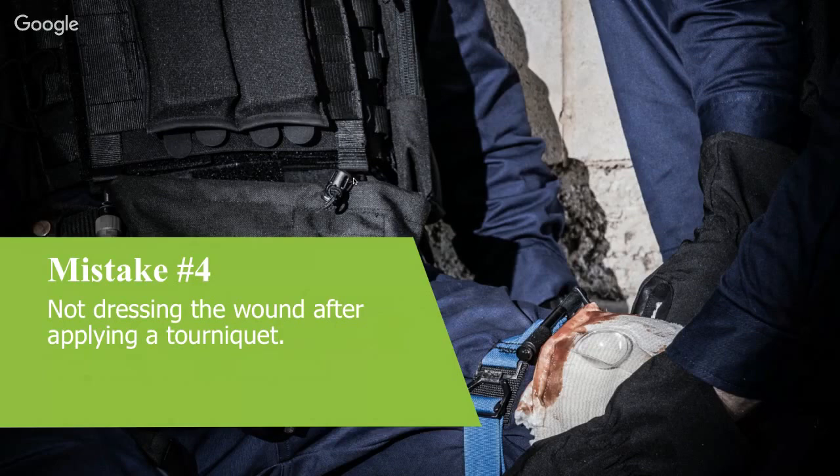The second thing is, apart from anything else, it will continue to ooze a venous bleed if you have an effective arterial tourniquet on. So you've got biological hazard just leaking out of your casualty. And if you want to evacuate them, it just makes it cleaner. That's not a life-saving thing. That's something that you come back to when you've got the time and when it's safe to do so.